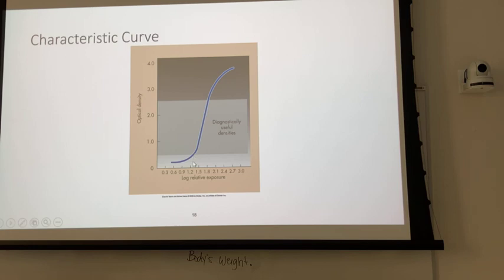This is a thin area, right? Let's say your ideal exposure falls right here, or even right here. You underexpose and you're going to fall down into here, but if you slightly overexpose, what do you get? Are you still in the sweet spot? Absolutely. So what do people do?